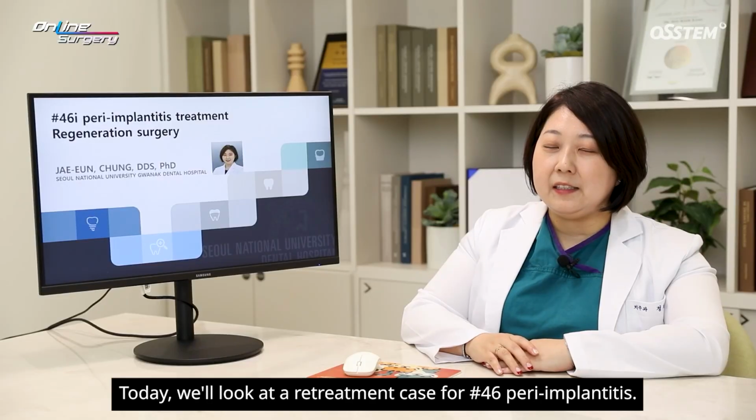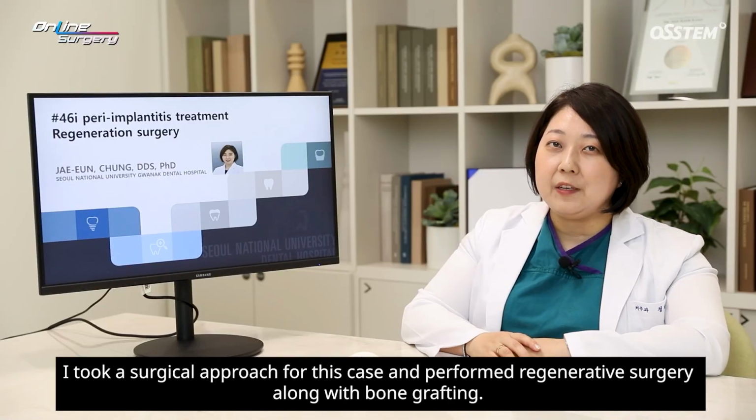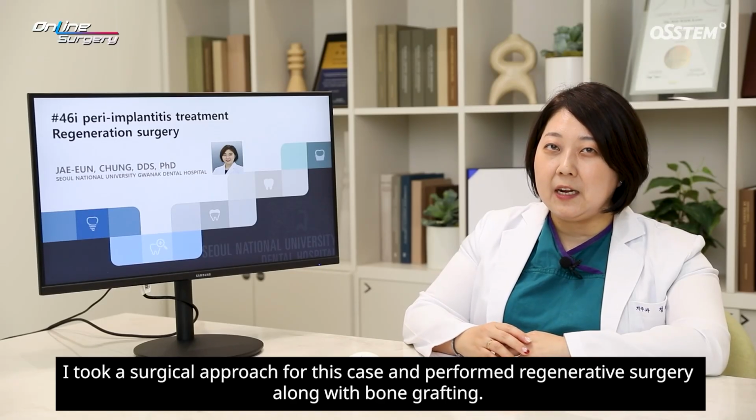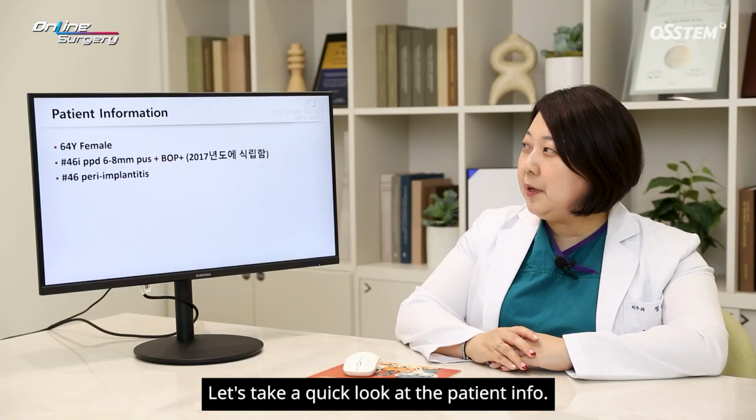Today, we'll look at a retreatment case for number 46 peri implantitis. I took a surgical approach for this case and performed regenerative surgery along with bone grafting. Let's take a quick look at the patient info.